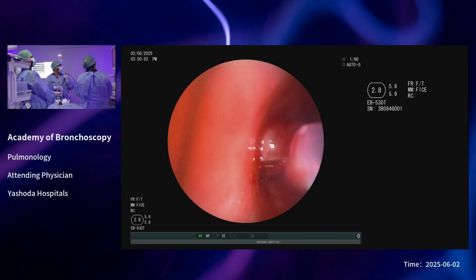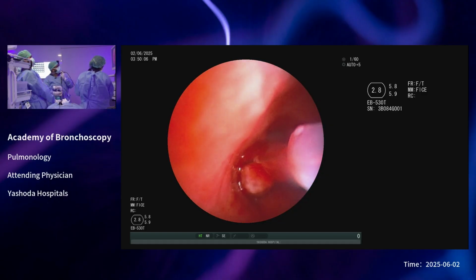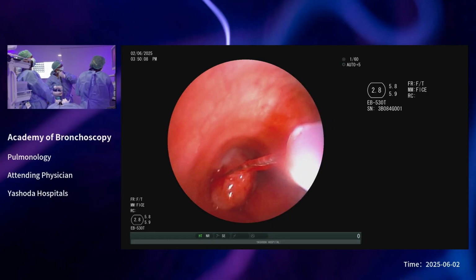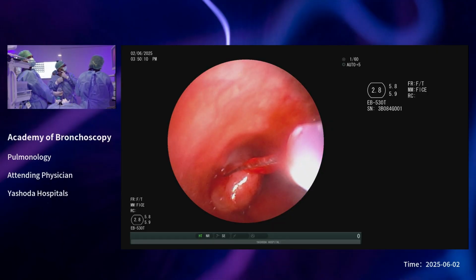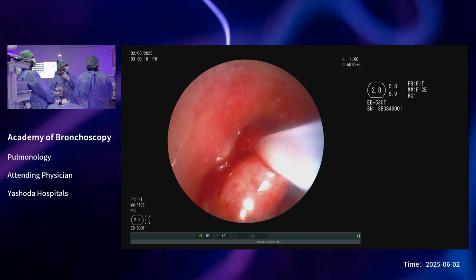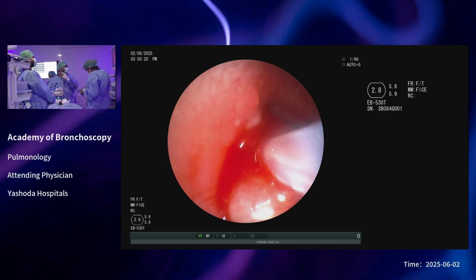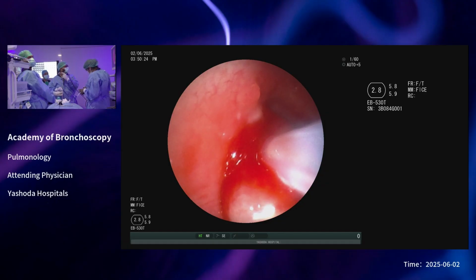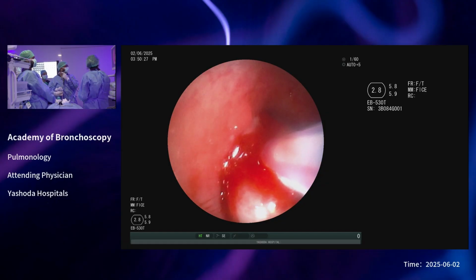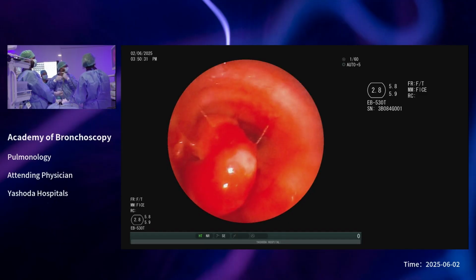Flex slowly. Yes, flexing, ma'am. Just see if both the sheath. Little more. Yes, ma'am. Okay. I'm feeling some resistance. Activate the pedal. Activating, ma'am. Press. Keep pressing. Slowly closing. Closing. Give away.